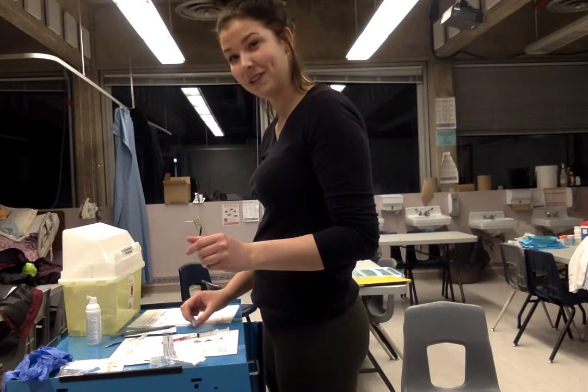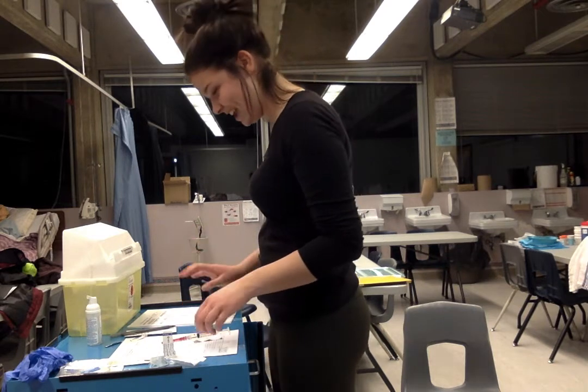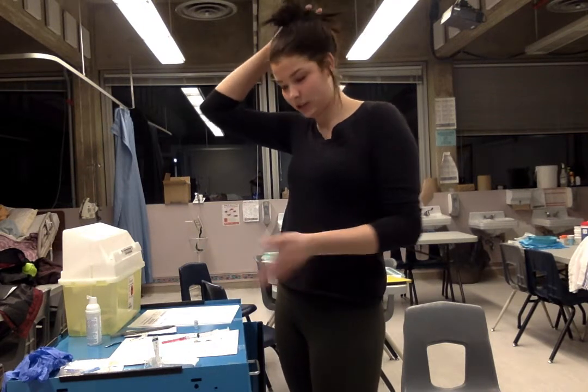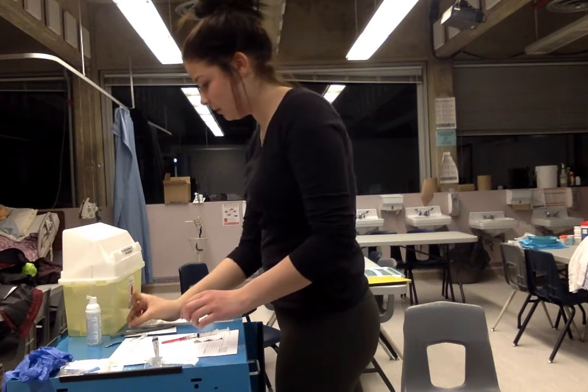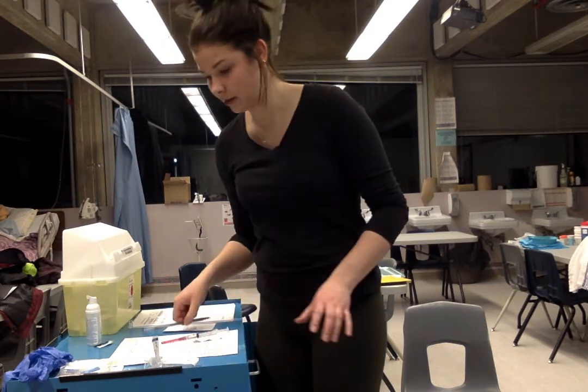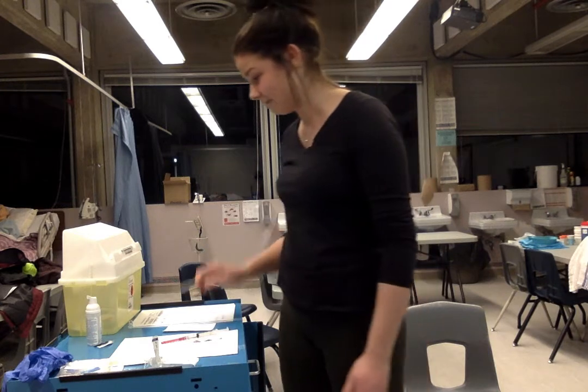We will just wait 1 second on that to make sure we have it all. We're good with our second checks. I will need a second witness when it comes to wasting it, so we'll just keep that for a minute. All right, would my second nurse come and just check that I've taken this? So she came, she checked, she knew what I was doing, she signed for it.